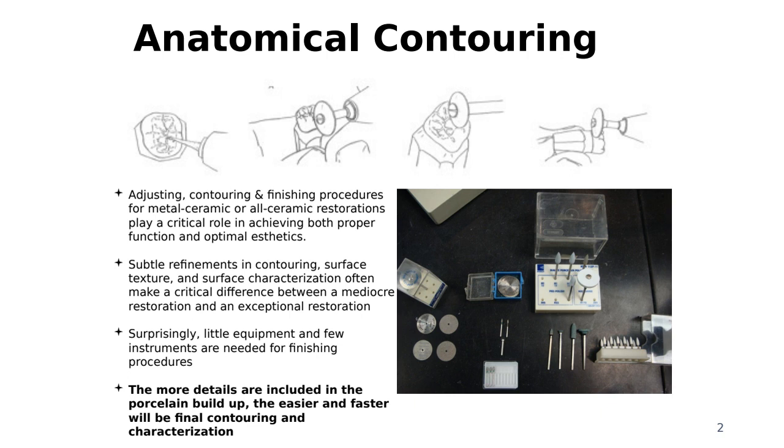We can use a lot of tools that we have at our disposal, but we have to know how we can use them correctly, okay? So this whole course teaches us how to use the porcelains and also the tools that we can use to shape the porcelain to give us that natural look, okay? So when we're talking about anatomical contour, in your mind, what do you think about it?